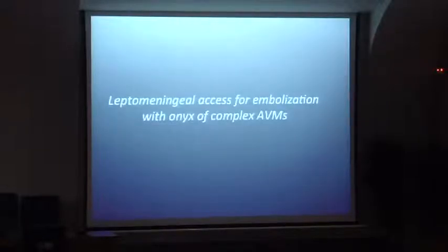Leptomeningeal access for embolization is another possibility. In the complex AVM, with the leptomeningeal feeder, maybe you know this is impossible to go to the nidus. No, it's possible to go to the nidus, and maybe it's better to go to the nidus to attack the AVM.